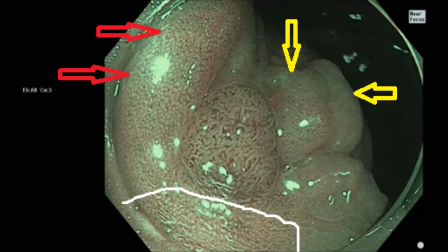It's also worth noting again that the pits within the scar, and you can see part of the scar below the white line, are uniform in size and spacing, but they're somewhat different than the normal pits in that they're a bit bigger. And again, we're going to see variable patterns depending on the phase of healing and the amount of inflammation in the base of the scar that are somewhat different from normal, but don't represent neoplasia.